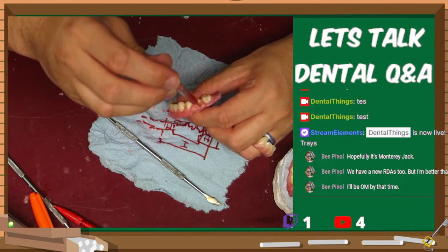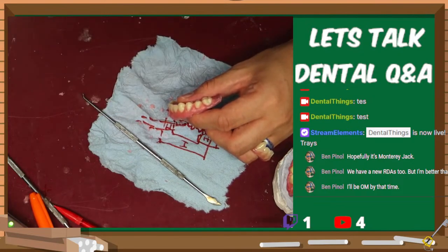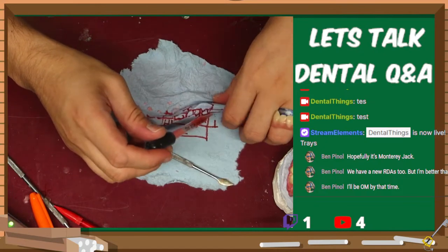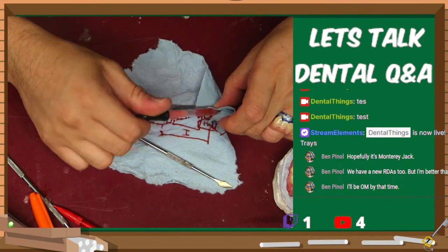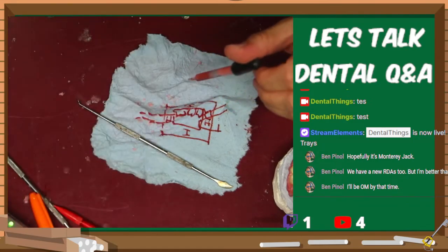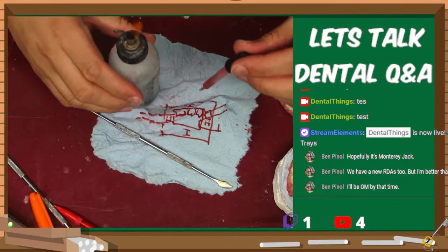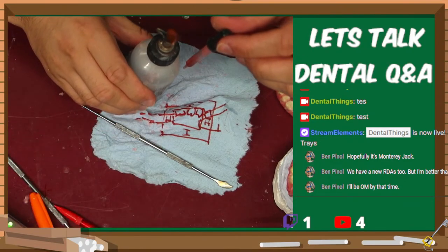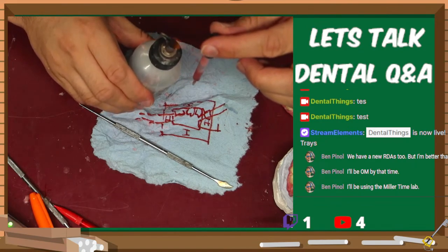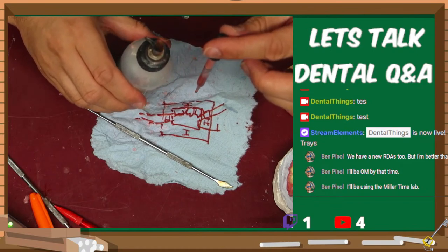Have a little empty area right here that I want to fill up. This vial is clogged, so I need to go and heat this up, which, there it goes.